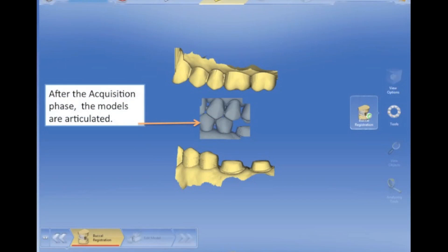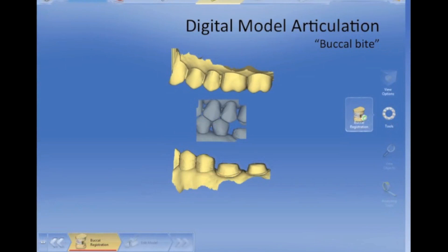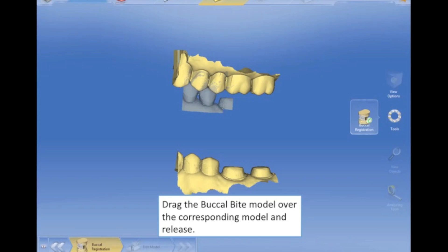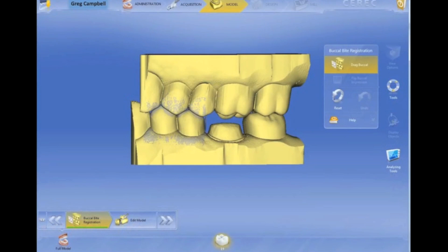Now we're going to do our buccal bite, which is absolutely fantastic — there's nothing new here except I just think it works better. I always stitch the lower arch, even though I'm going to show you the upper arch first. I think the engineers in Germany prefer it that way, but I think it works either way very well. You're going to grab the gray, bring it up, let go of it — it's going to grab it — then grab the gray, put it onto your lower arch, and you're going to get your stitching. This is an incredibly accurate way of doing your bite.